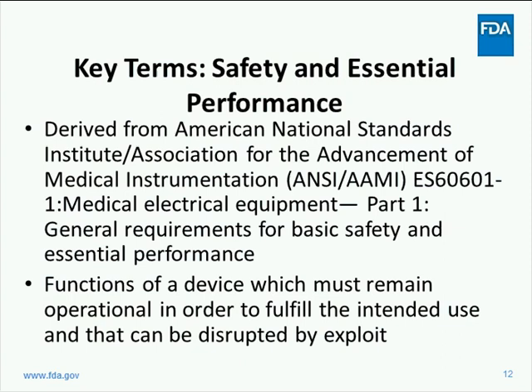The use of the term essential performance is in alignment with IEC 60601, 2012's definition of essential performance, and is synonymous with the intent of the draft guidance introduction of the term essential clinical performance. The utility of the term essential performance is to key medical device manufacturers in on the clinical functions of a device where loss or degradation due to an exploit would result in an unacceptable risk. The risks may be any number of business and organizational risks, including loss or degradation, that present a risk of patient harm. The terms safety and essential performance are not intended to be mutually exclusive.